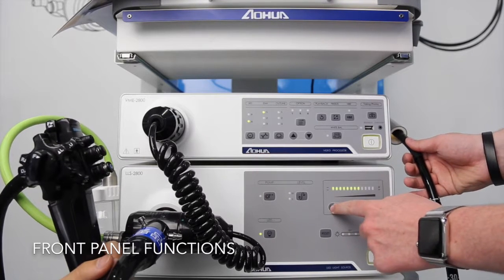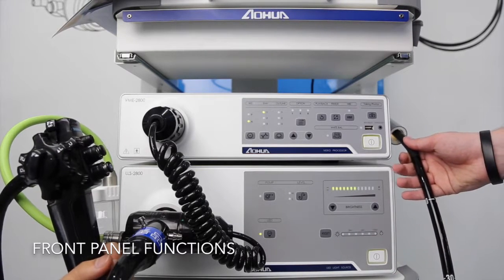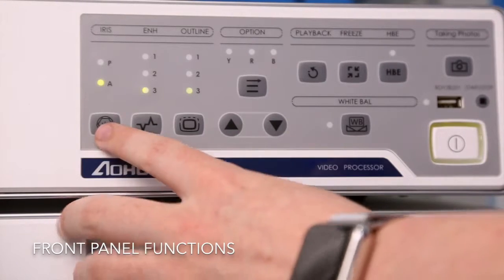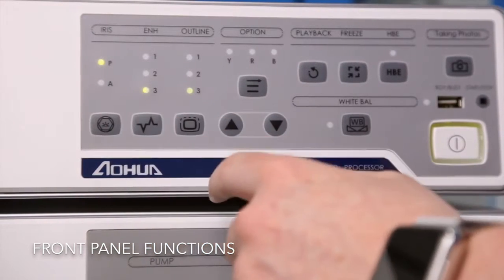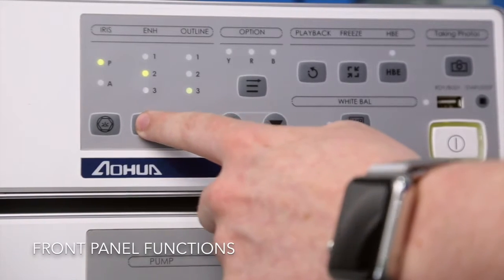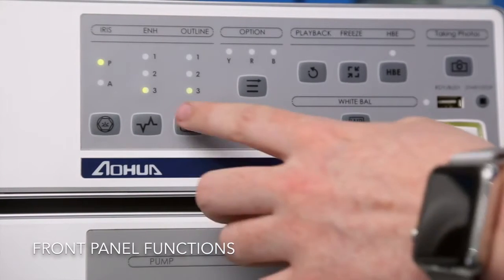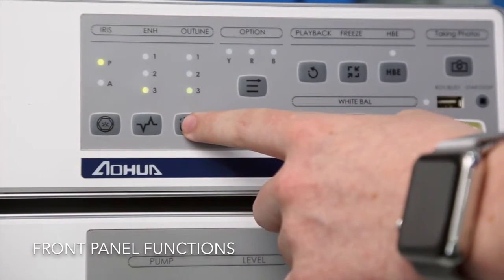This is used to adjust the brightness of the LED, and this shows the lifetime of the LED. This button is the iris — it's set to average by default but also has a peak function. This button is used to adjust the gain, with three different levels. And this is the enhancement level of the image, again three different levels.